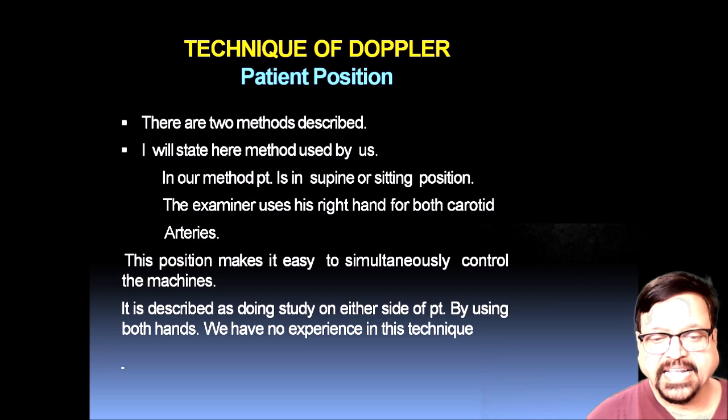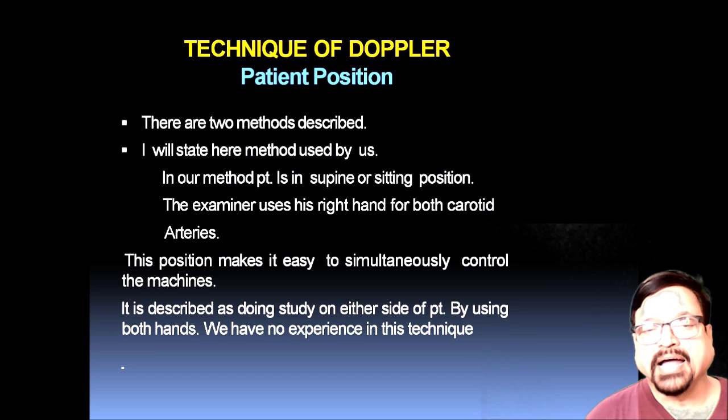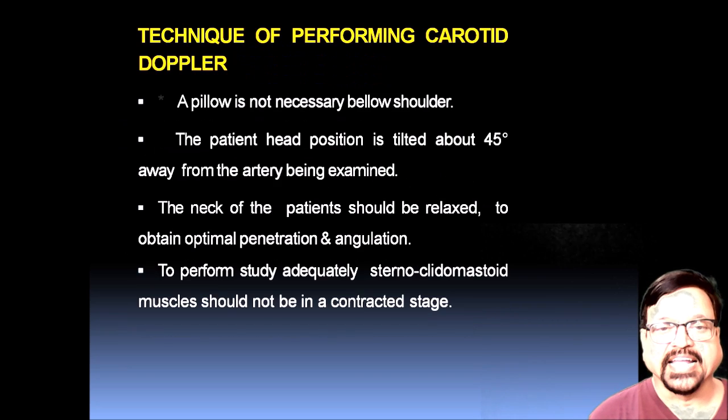This position makes it easy to simultaneously control the machine as well as probe positions. It is also described as doing the study with both hands by sitting on either side of the patient. However, since we are not doing it, we have no experience of this technique.